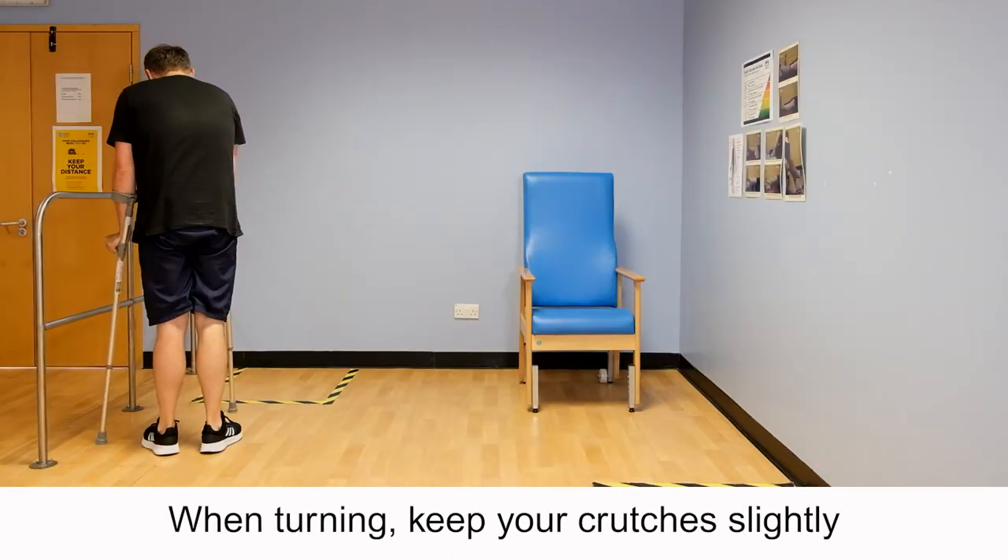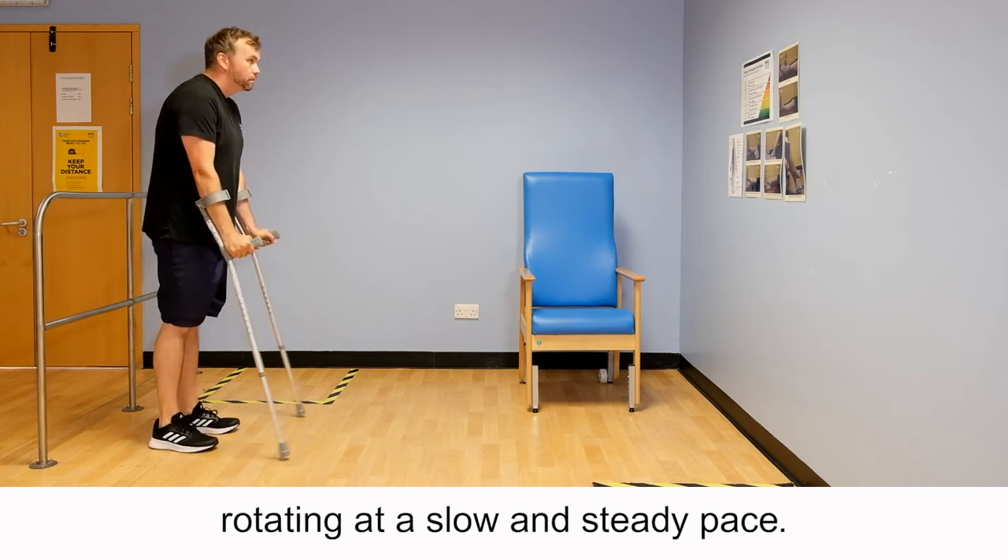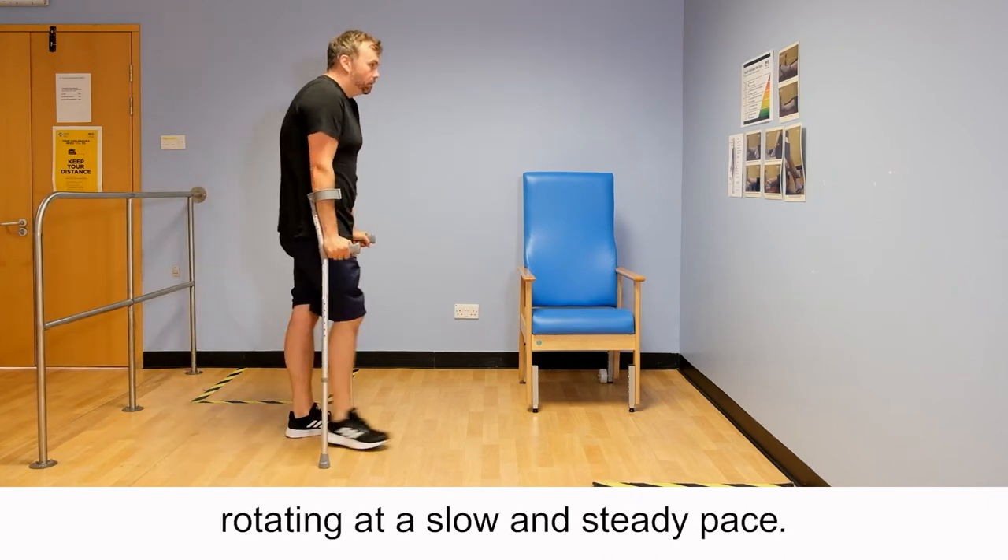When turning, keep your crutches slightly ahead of you, shoulder width apart, rotating at a slow and steady pace.